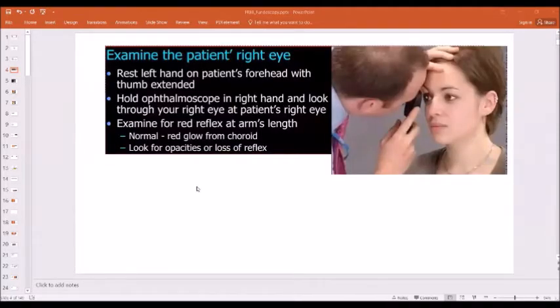So how to start now? Get ready. I am requesting the candidates to be with us in the virtual classroom. You are entering now a PACES station where fundoscopy will be given as a case and we will be discussing. Many books and texts have written many more things, but simply, what will be the best procedure in my sense, I'm sharing with you.